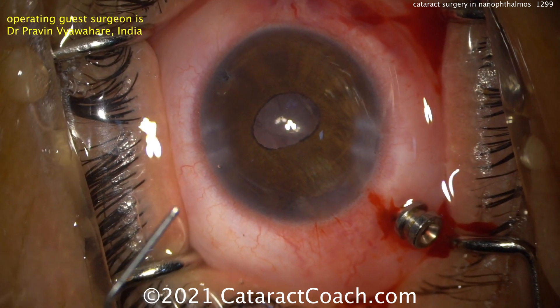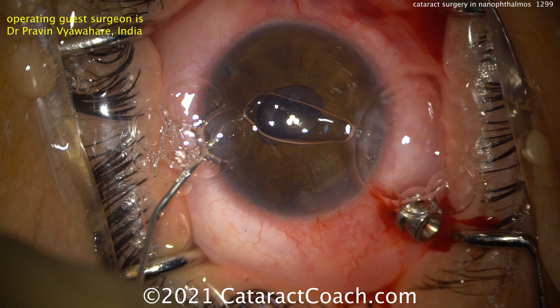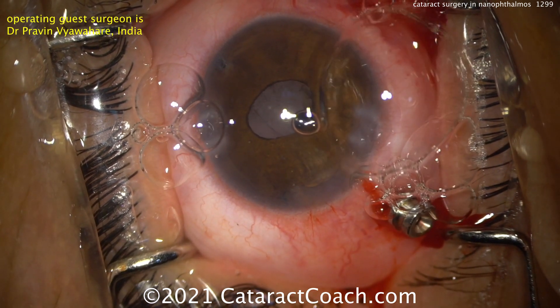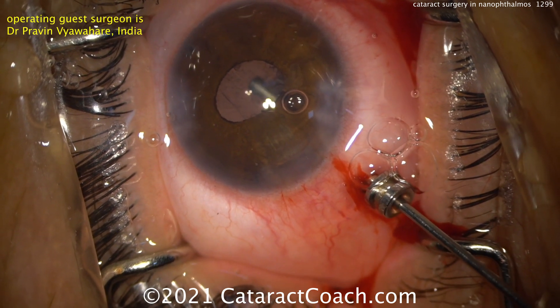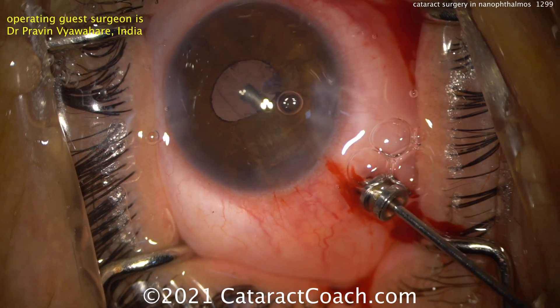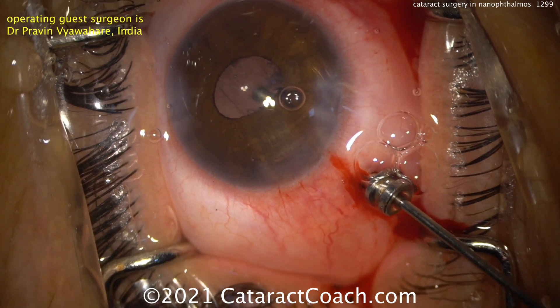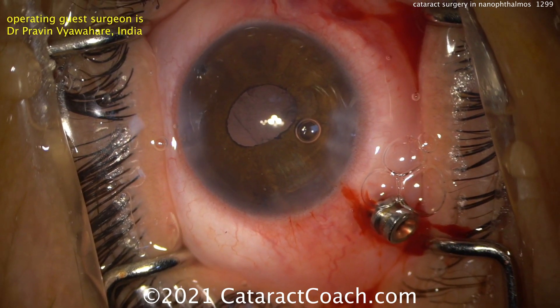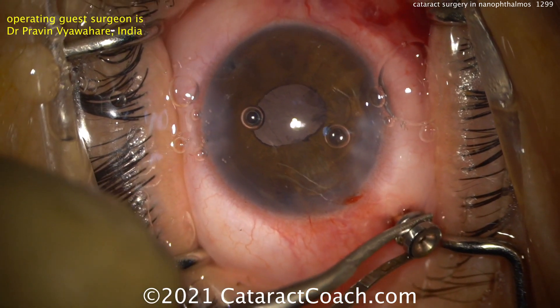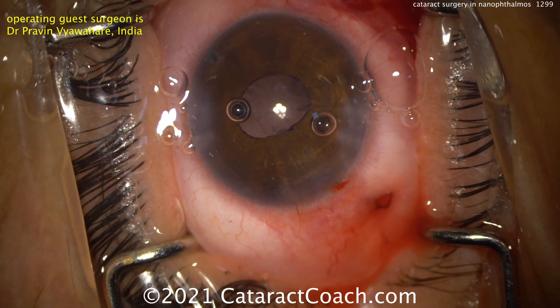Finishing up the case — remember to check the entry site. Let's look at a post-op picture too. A little more cleaning up here; make sure everything's absolutely watertight. This patient should have a very reasonable outcome — perfection? No. Reasonable? Yes. Very nicely done. Take that trocar out, remember to check that retina. Very nice case — thank you for submitting it.